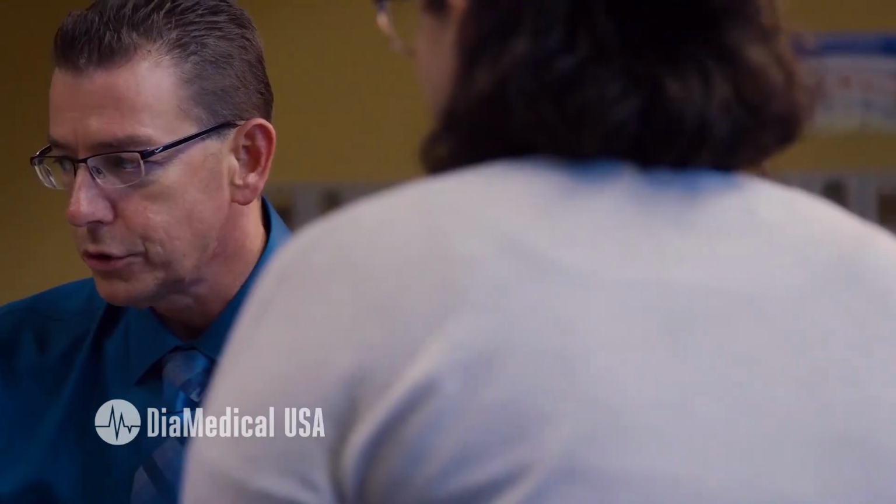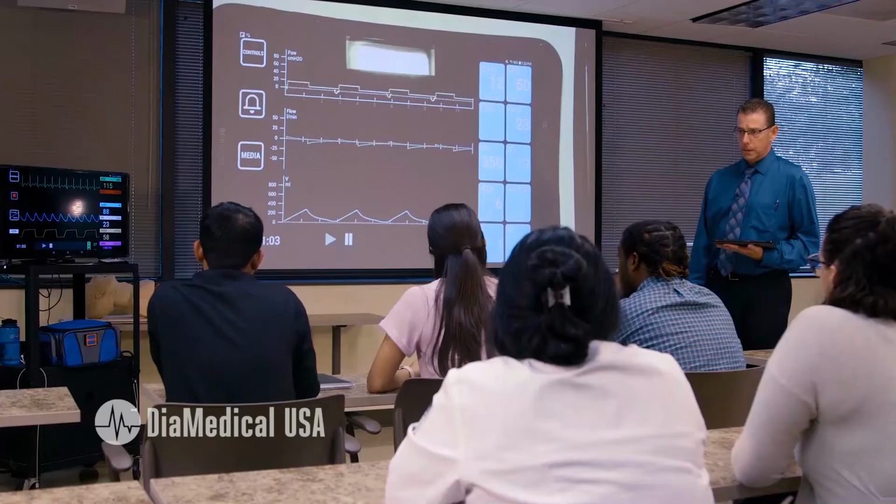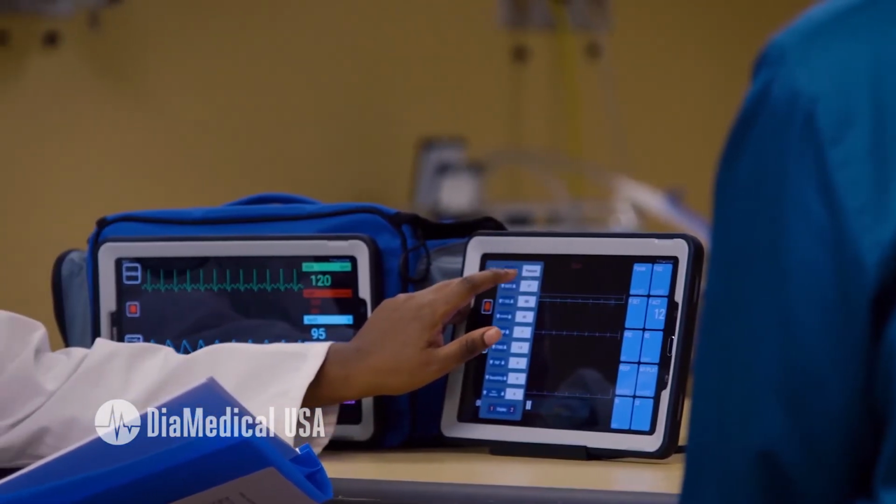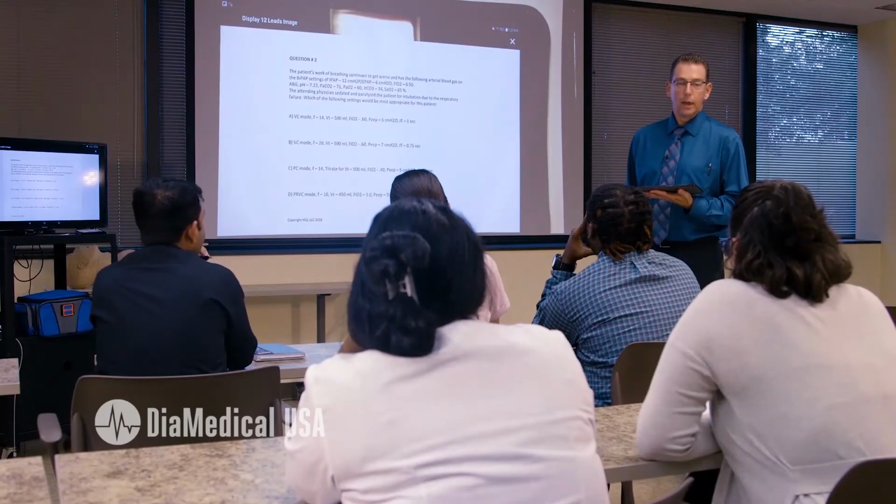Okay, Steve. Some of the benefits of the VentiSim scenarios are that you can use this as an educational tool. You can do it in the classroom setting, in the lab setting, in small groups, and in large groups. You can have multiple discussions as you're going through the simulations. You can have the students do a lot of different aspects of taking care of the patient, like interpreting blood gases, calculating compliances, calculating airway resistance.